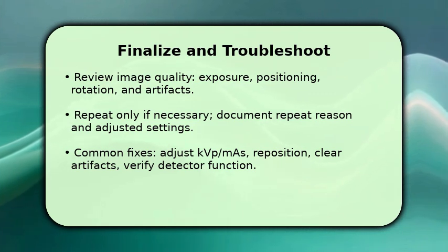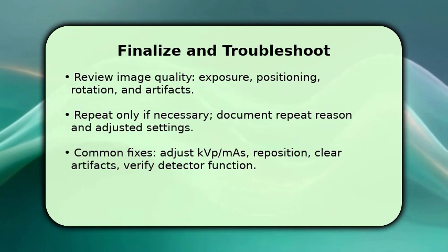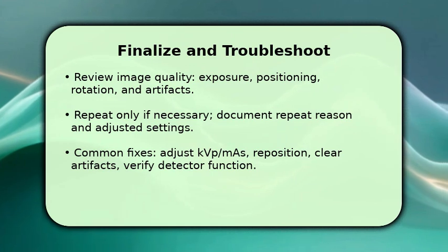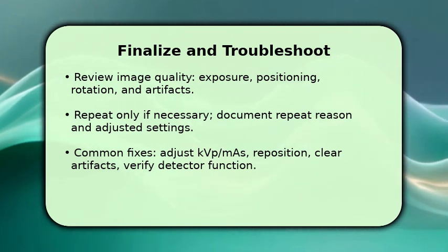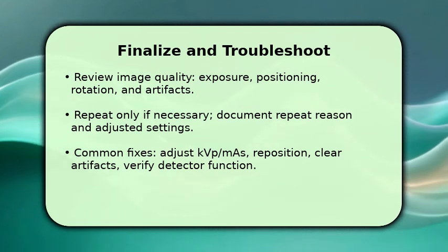If a repeat is needed, document the reason and change technique deliberately. Adjust kVp or mAs, reposition the patient, or correct centering. Verify detector and cables if strange noise or artifacts appear. If persistent, switch to an alternate detector or consult service.